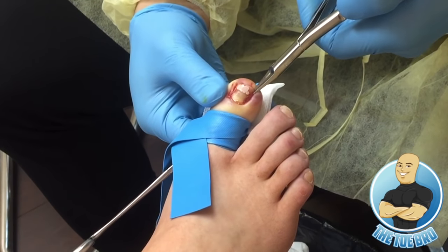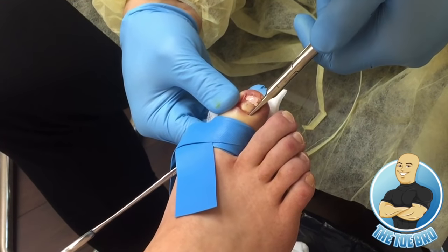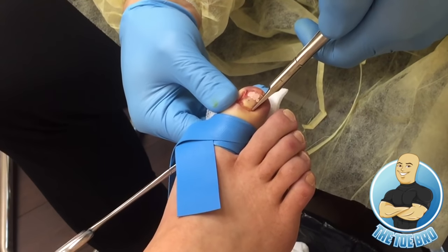So right here, we decide what's the proper portion of the ingrown nail to cut out, and we cut all the way down underneath the cuticle.